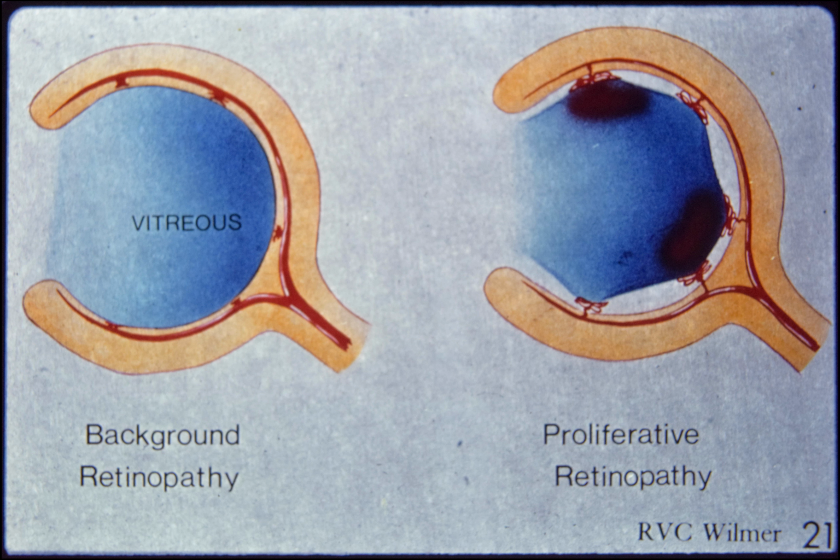The use of light coagulation has been an intriguing, rational, but unproved form of treatment for diabetic neovascularization for a number of years. The diabetic retinopathy study was designed to evaluate the effect of both focal and scatter argon laser and xenon arc photocoagulation in patients with proliferative retinopathy.